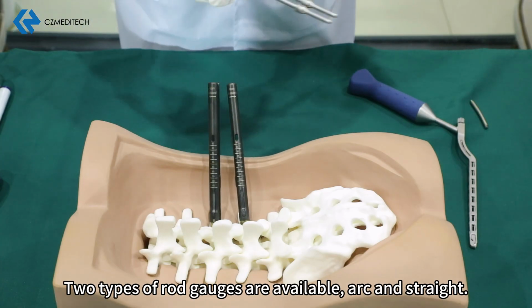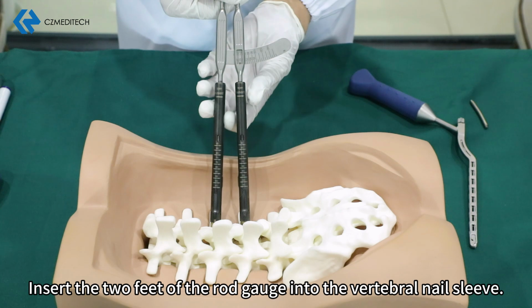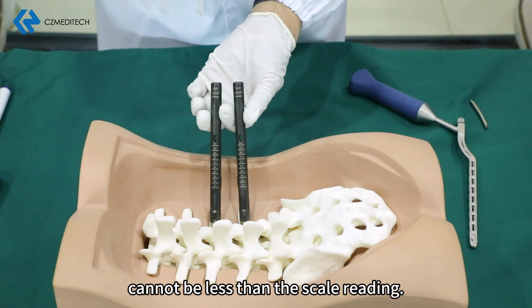Two types of rod gauges are available, arc and straight. Insert the 2 feet of the rod gauge into the vertebral nail sleeve. The length of the desired bar can be read directly from the ruler. The length of the picked bar cannot be less than the scale reading.